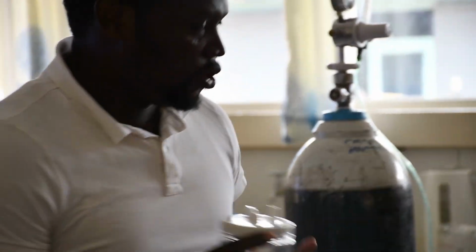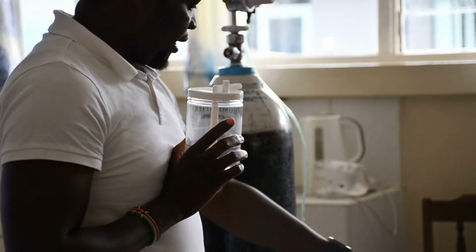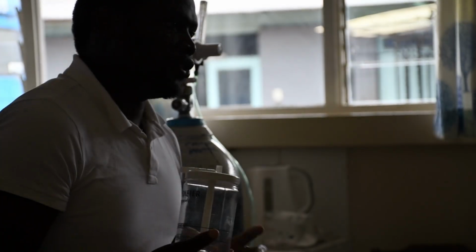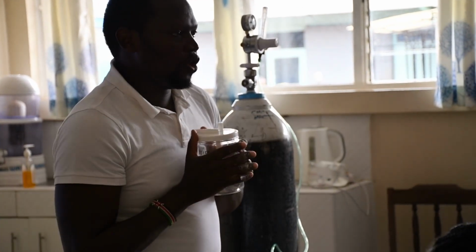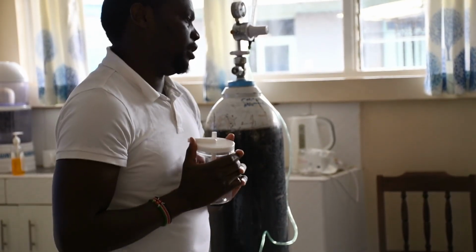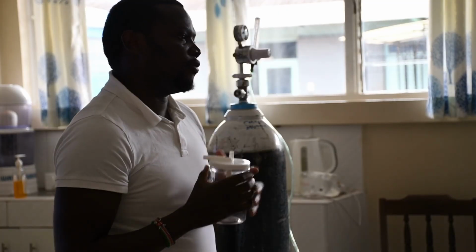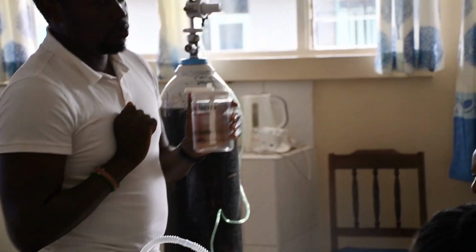So from the humidifier tubing you go to the humidifier itself. So remember your gases are coming in, you blend them, you filter them. Now you want the humidification to happen before it goes to the patient, because you don't want to provide dry gases. Okay? So we know that dry gases are very harmful to the airway of neonates, especially prematures whose airways sometimes are not even developed. So you'll have a lot of thick mucus develop, and also just the drying effect of the airway that will provide some sort of injury. So you want to do the humidification.